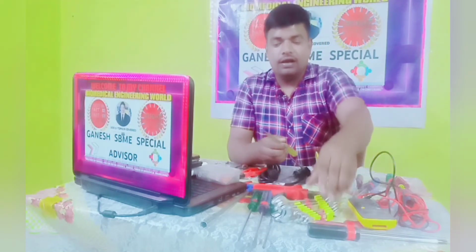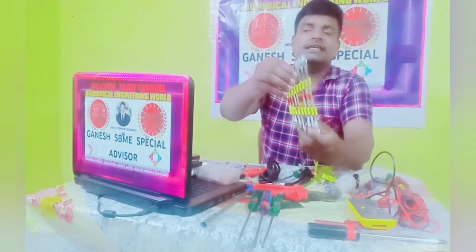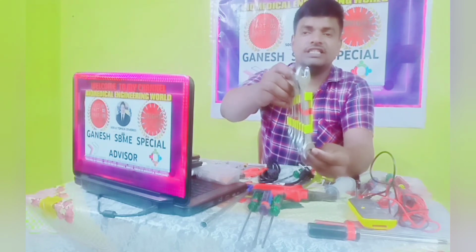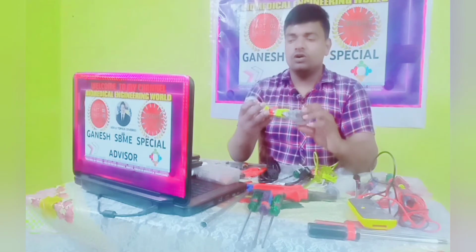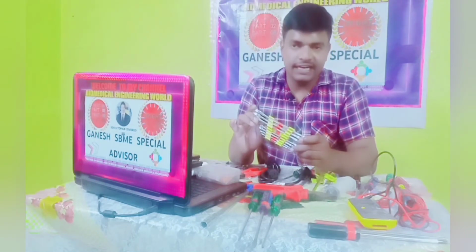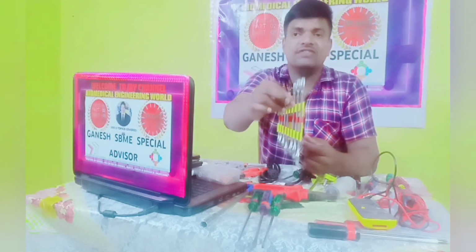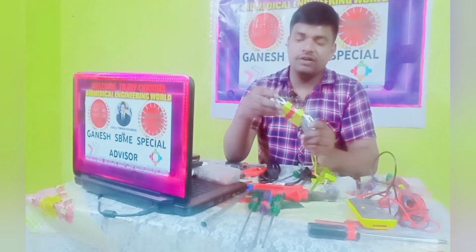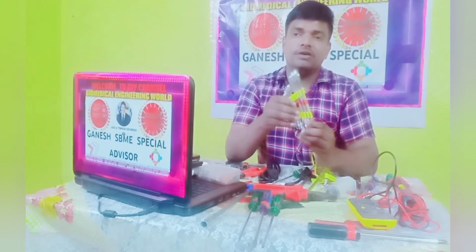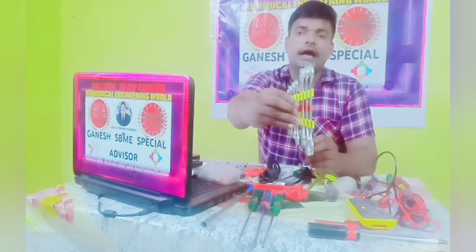Next one, this one, the spanner kit set. In this spanner kit set, all sizes 12, 13, 14, 15, 16, 17 are available. This spanner kit is mostly used in multiple devices wherever required, especially huge equipment, for example ventilators and anesthesia ventilators, and many things where long screws need to be opened and very critical parts need to be opened. By using this we can open the inside parts. This is the spanner kit.